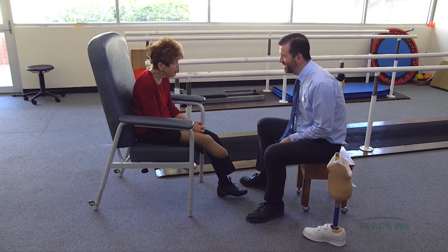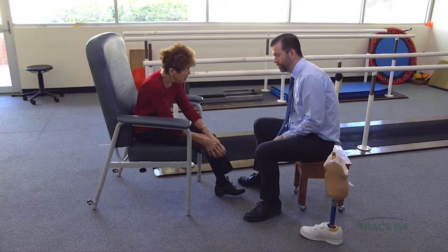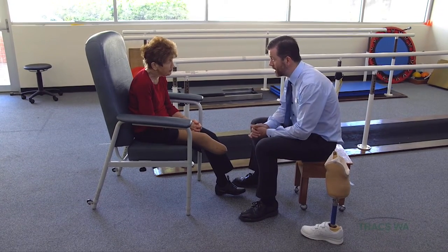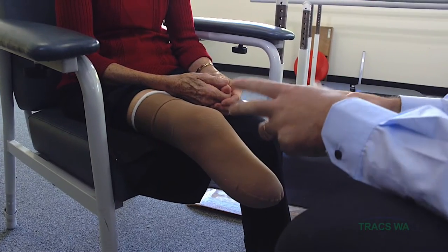Good morning, Val. How are you? Good, thank you. So you're ready for the next stage, Val. You've been wearing your shrinker, and that's reduced some of the swelling. Your stump's nice and healed.